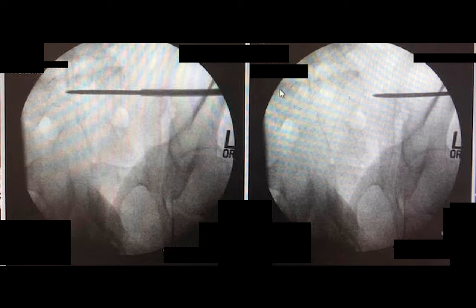But basically, I'm doing the same thing as a pedicle sound would. I'm using the threads of the wire to back out, not all the way out of the pelvis, obviously, but just beyond where the dangerous area is, just to the SI joint, so that I can still find my way back in. It's kind of hard to show you, but imagine this as your hole and your guide wire is right here.